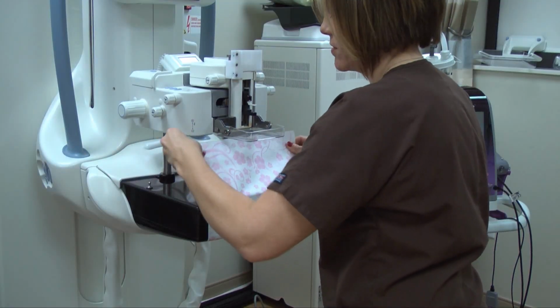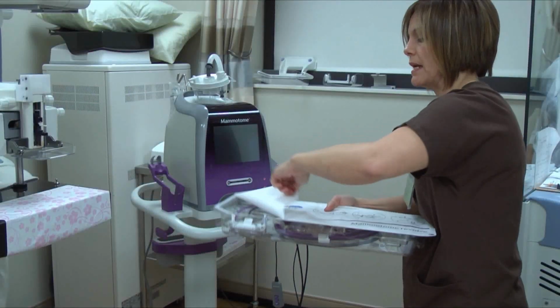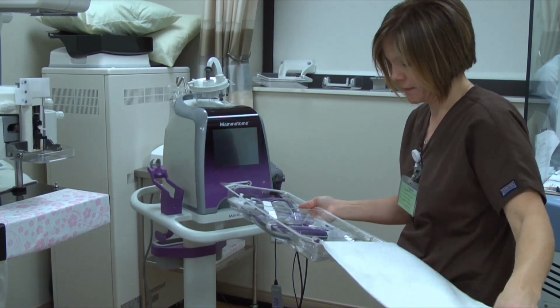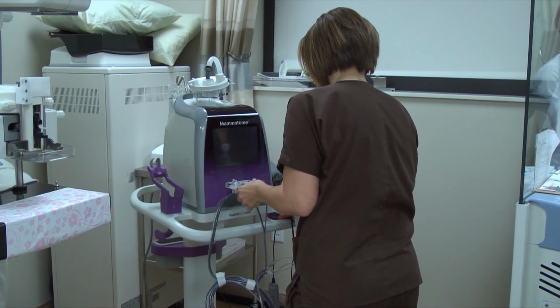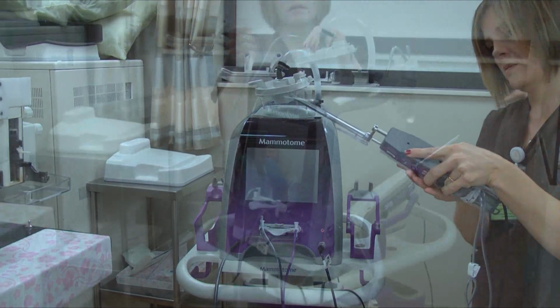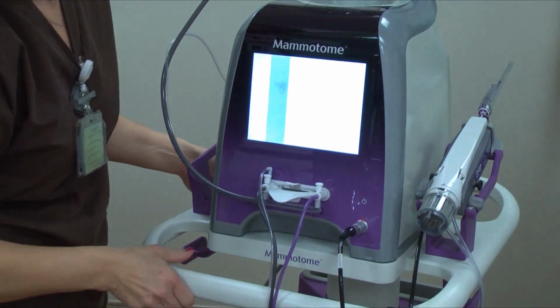A Bella blanket is placed over the unit, and the chair is draped. The Mammotome Revolve ST probe and vacuum set are removed from the sterile packaging. The probe and vacuum tube sets are plugged into the control module and are attached to the ST holster. Tubing is connected to the canister and saline. The control module is powered on.